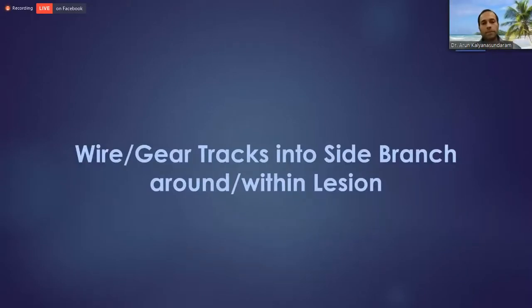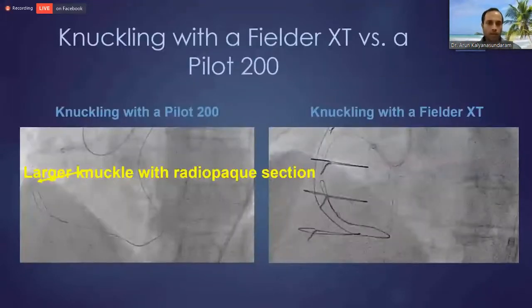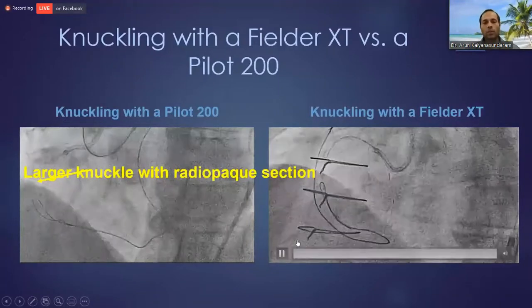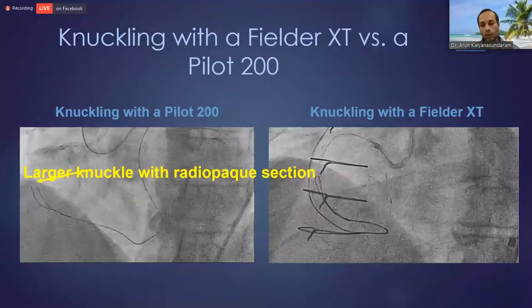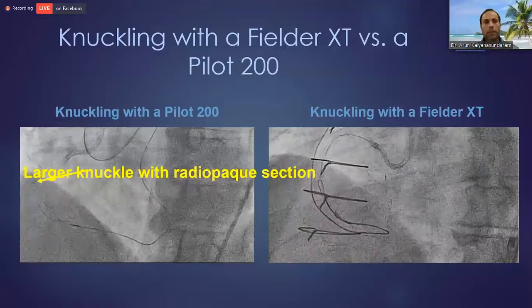Okay, so sometimes, again, I maybe will take another 5 minutes. Again, a little bit more about knuckling can help you. Different wires can form different knuckles. Understand how to make a knuckle, what wire makes what knuckle. That's a separate talk by itself, so I'm going to keep going.